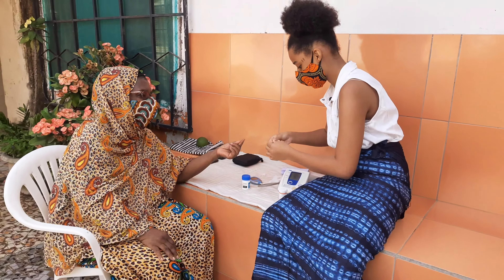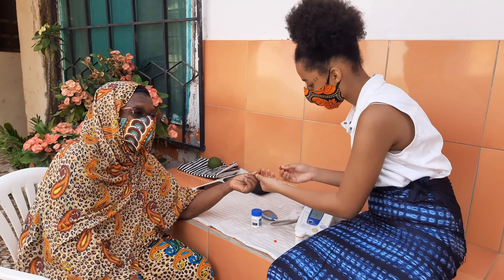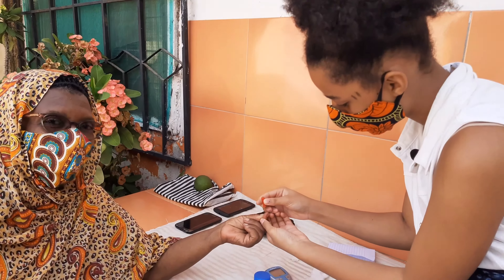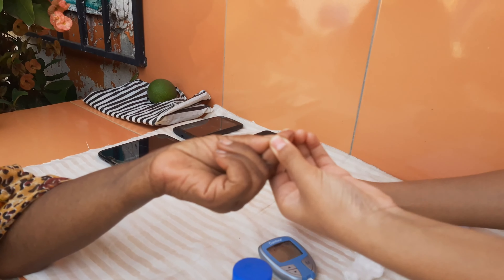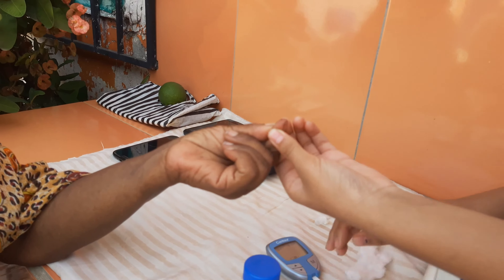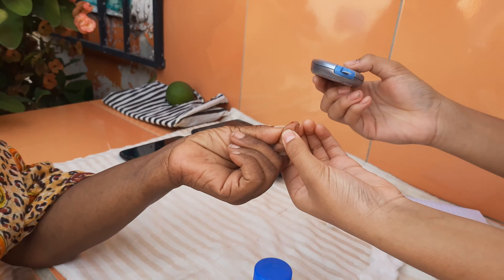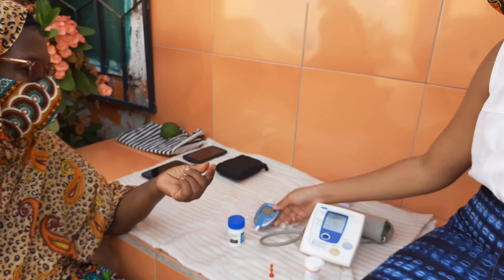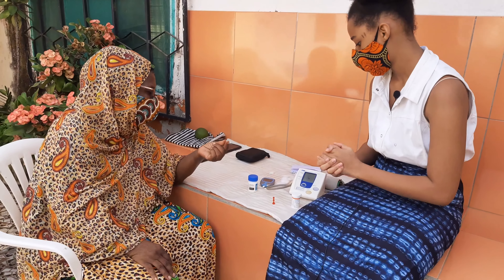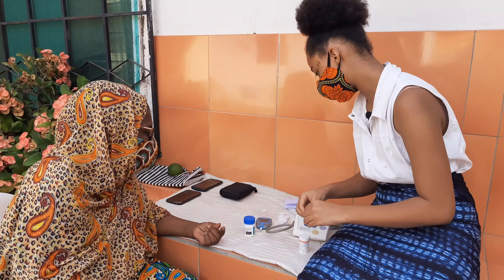And now comes the scary part. Now comes the scary part. Ready? Yeah. One, two, three. There you go, just like that. Now I'm going to click — this finger prick is very scary. Absolutely. Now you wait... 142.